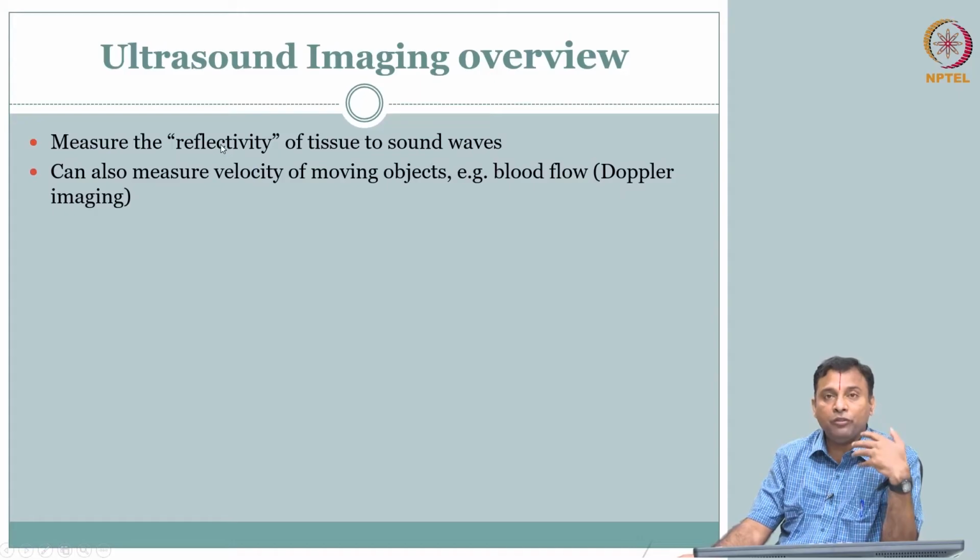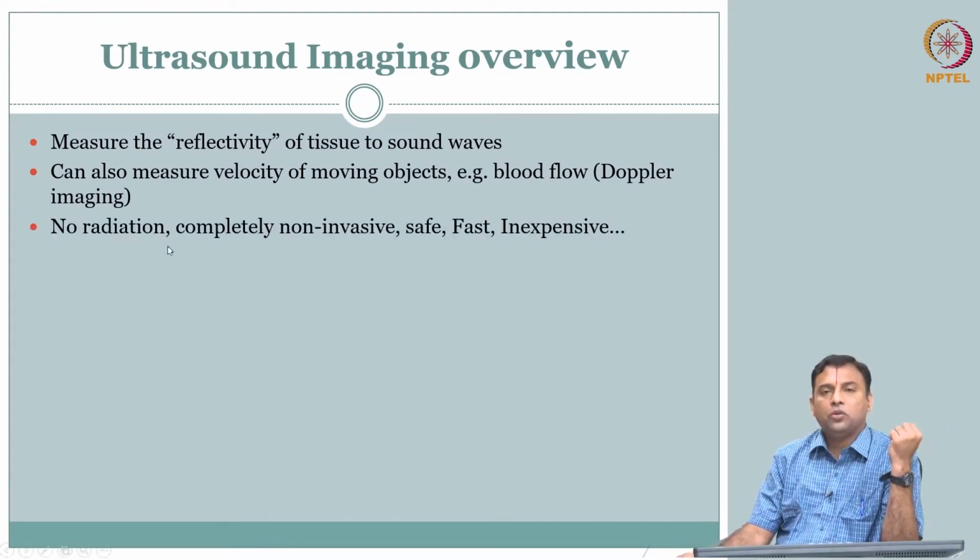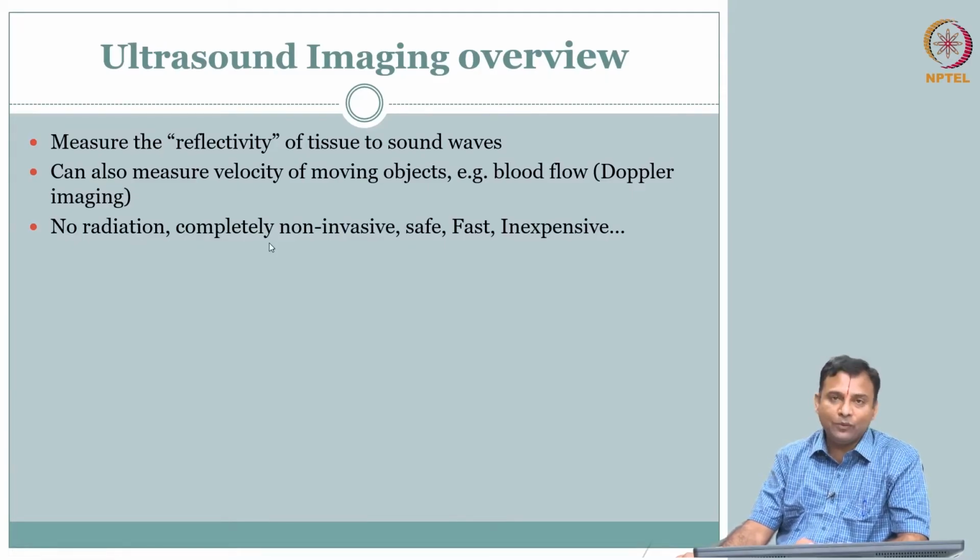So, this is new information that we are getting, and that itself is very powerful, right? You are using a newer modality, and you get to see new information about the target object. Comparatively, here there is no radiation, compared to the previous modalities we have covered so far, and it is also completely non-invasive. You are going to sit outside and see what is inside the body, right?